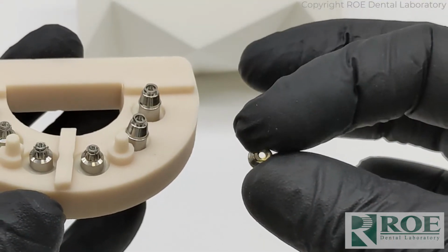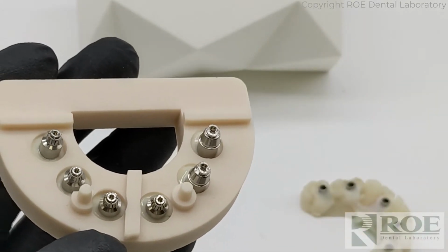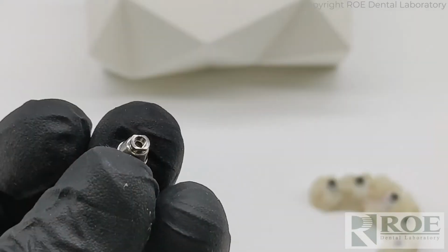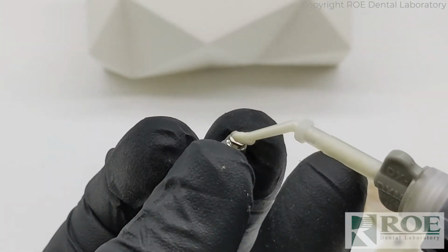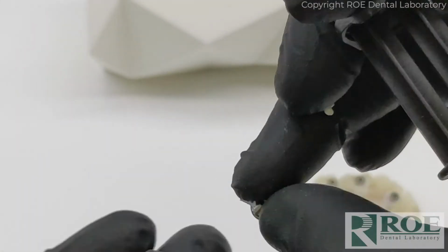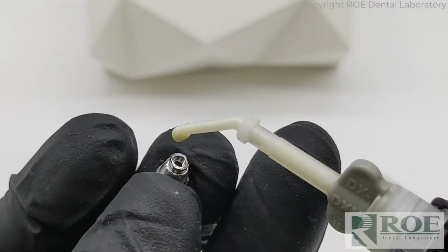You can do that before surgery. You can just open up all these packages and block them out. You can use PVS, you can use some composite. In this case, I'm just going to use a little dab of Stellar. Let me show you the process. It's very, very simple. You just put a little dab on top like that, and then just hit it with your glove. It's a self-cure, so just let it set, and then add some to the next one. So just block it out.